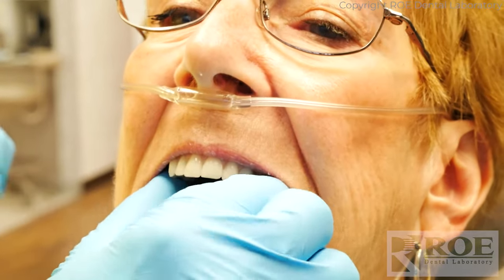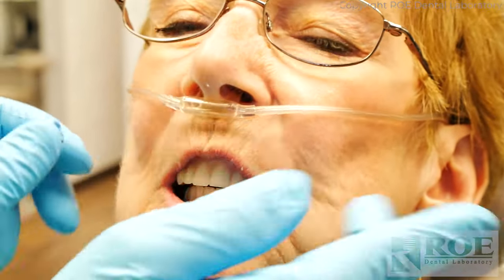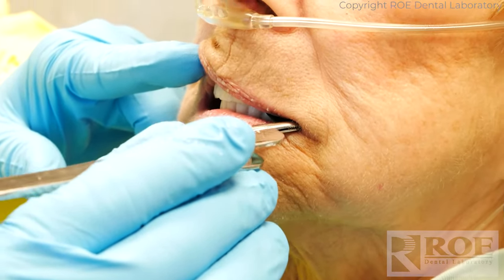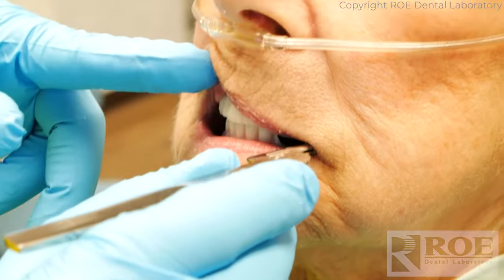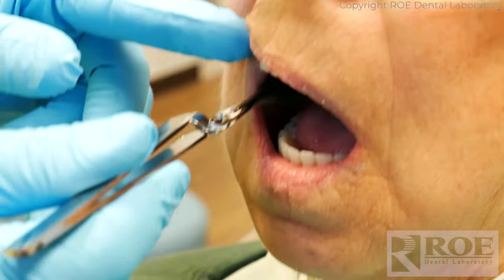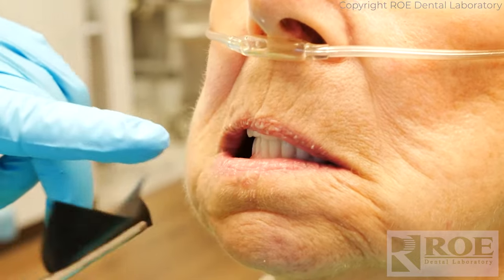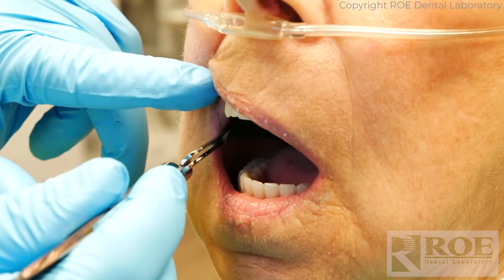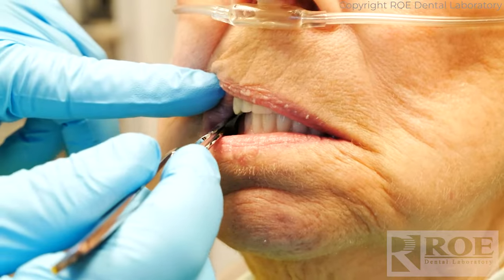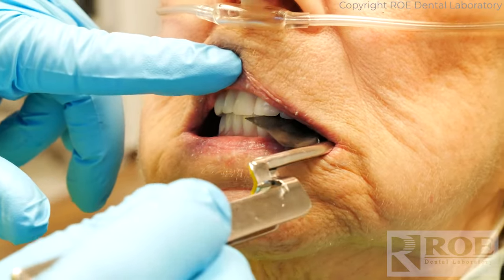Now let's check the plate — that's the next step. You can rest, you can close. Let's look at the lip — a little bit so your lip can rest. Good. She went forward — can you stay closed like you're clenching? Excellent. And open for me again. Can you bite down? Can you stay closed like you're clenching? Thank you. And open again. Bite down on your back teeth. Stay right there and open again. And bite down on your back teeth again. Now I'm just watching — no paper. Excellent.